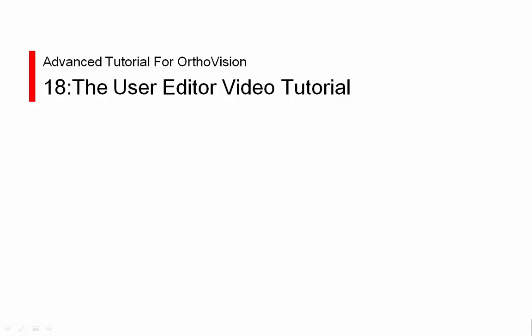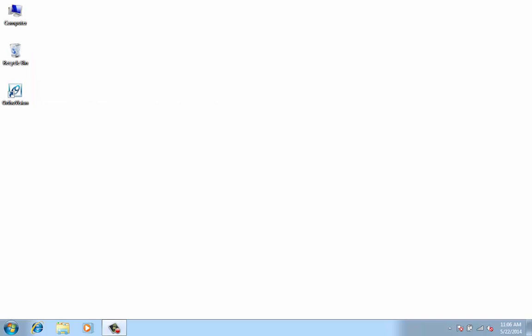Welcome to the user editor video tutorial for OrthoVision. In this video, I'll show you how to manage your user accounts using the user editor which comes with OrthoVision.